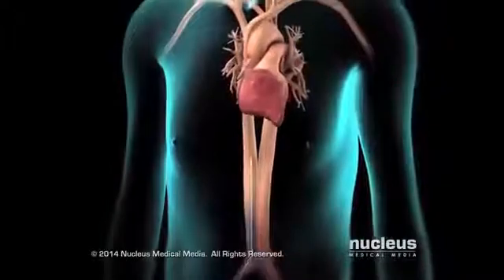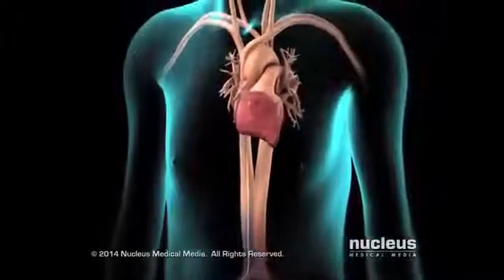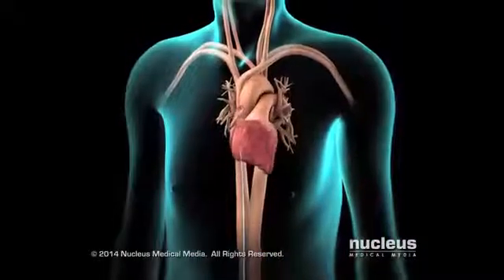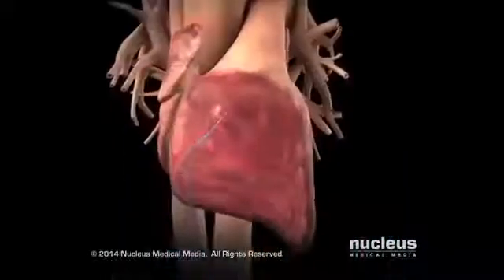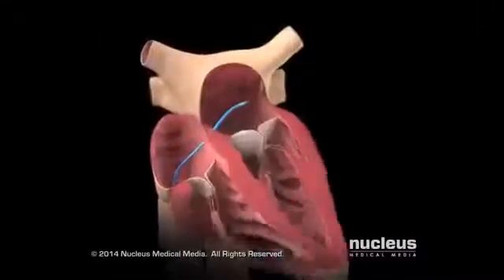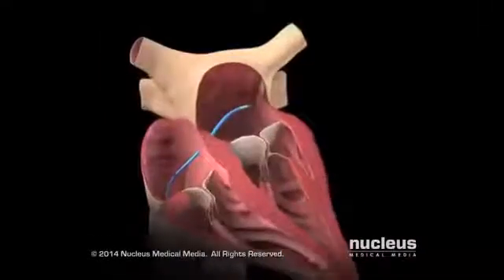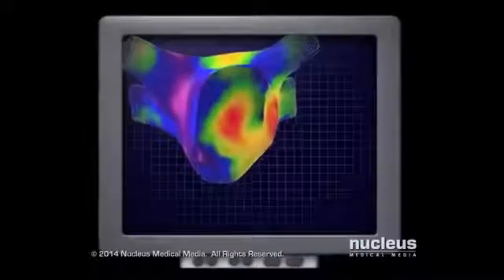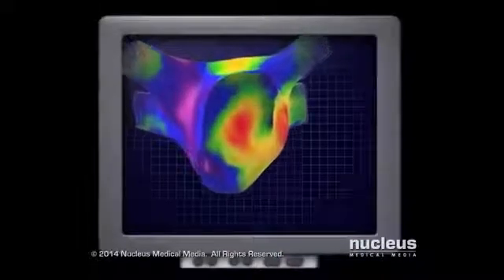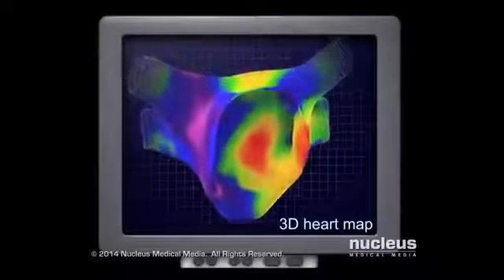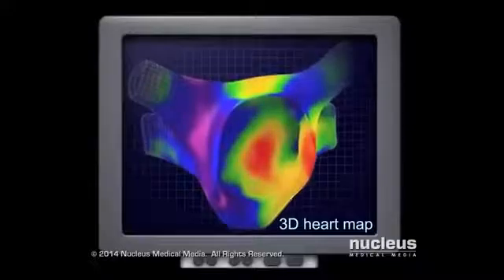The location and progress of the catheter will be monitored. When the catheter reaches the heart, the doctor will guide it to the area that is causing the arrhythmia. The doctor will find the problem areas using a 3D map of the electrical activity of the patient's heart.